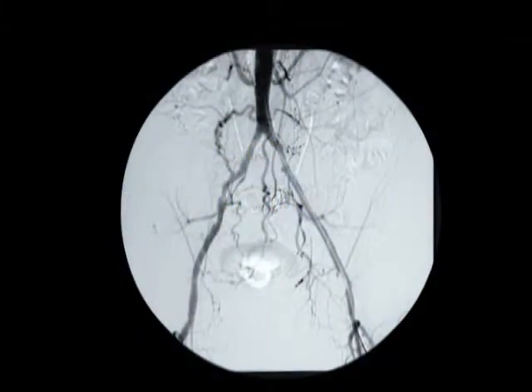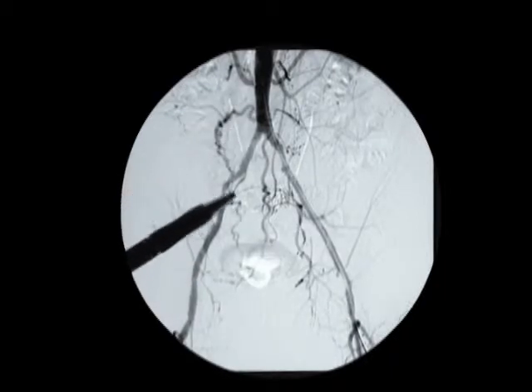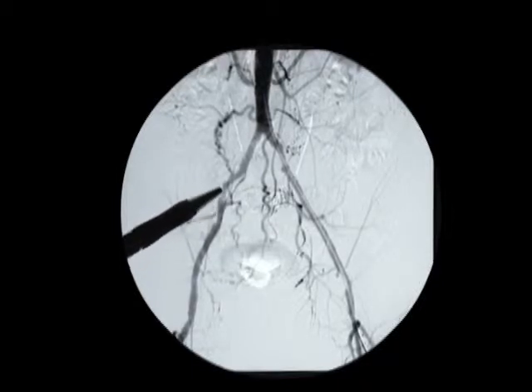In this study, we see an aortogram in runoff. Access is via the left femoral artery, and on the right side we see a mild stenosis of the distal common iliac artery. This is hemodynamically insignificant based on catheter pullback measurements, and therefore no additional treatment is required for this lesion, and the lesion does not represent an exclusion from the trial.